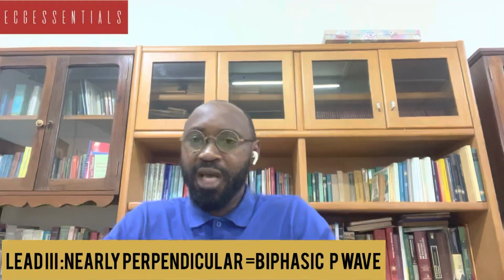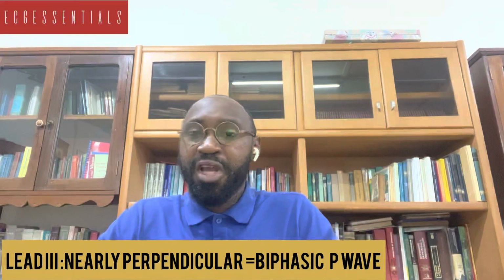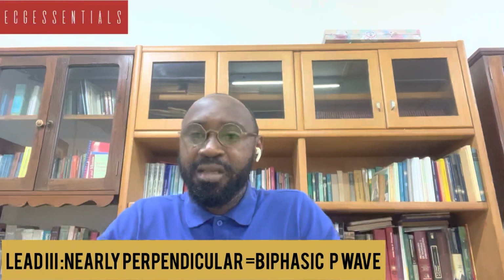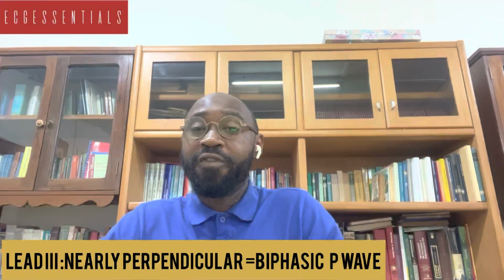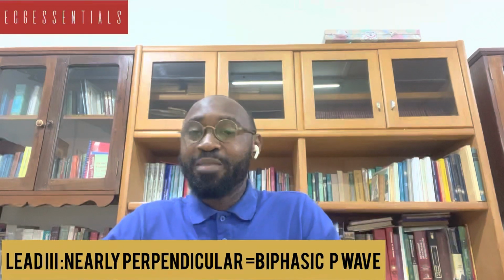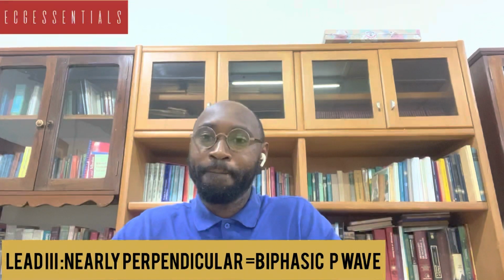Lead 3 lies nearly perpendicular to the direction of the overall vector for the atrial depolarization. So we expect that we will have a biphasic P wave in lead 3. It is not always the case, but per the understanding we are trying to put across, that is the expectation.